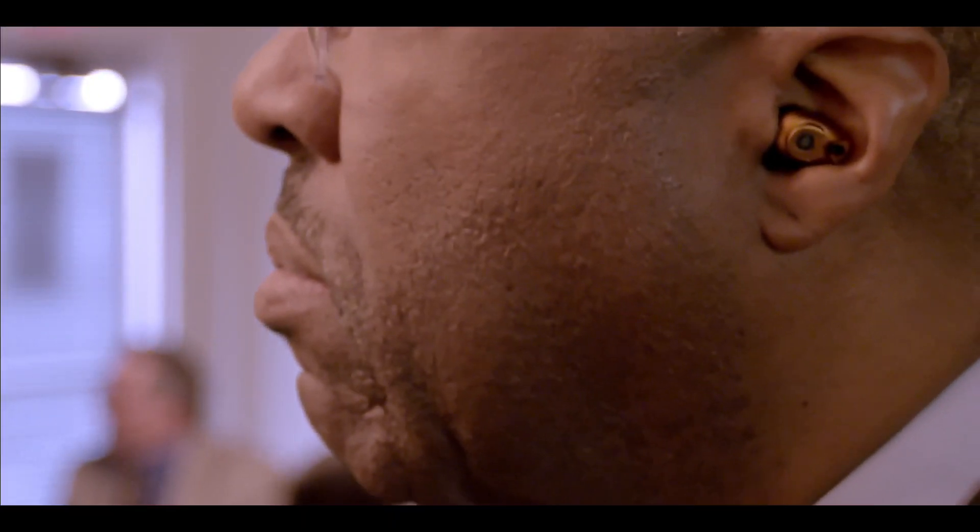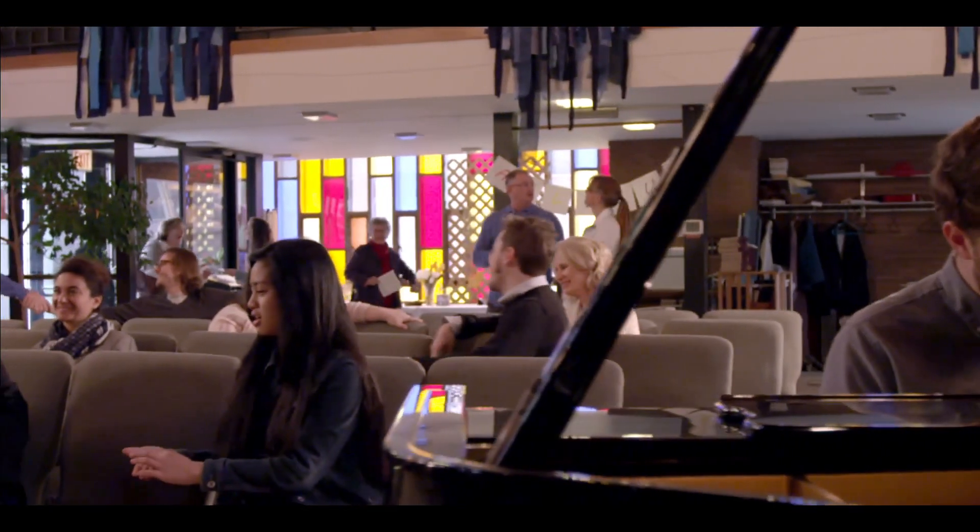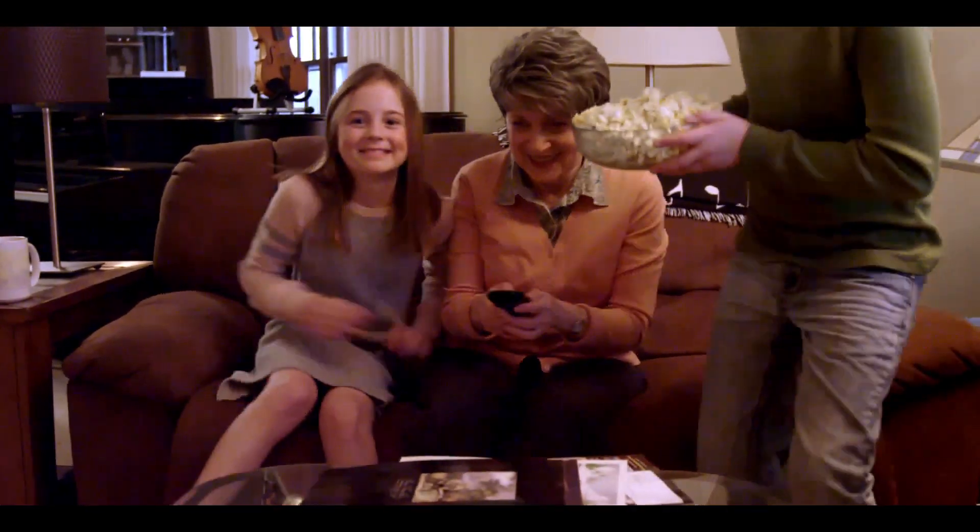Use it when you need it, take it out when you don't. The Bean is intended for anyone who wants to make their world one click louder. In other words, it is designed for people of any age who want the ability to communicate easily and effectively with family, friends, and colleagues in business and social situations.